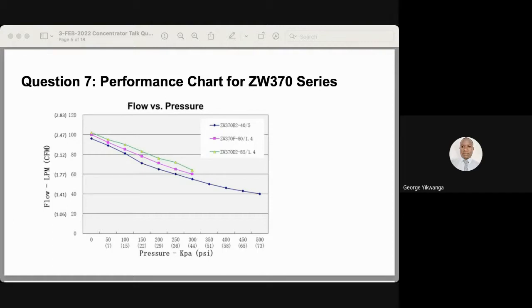According to 2660 and 2650 datasheets, both of them can produce more than 44 psi. As such, they can work well in 515. Just to point out that some models of 515 use Thomas 2660 and 2650 compressors. Thank you.